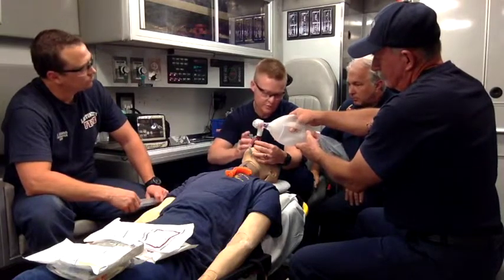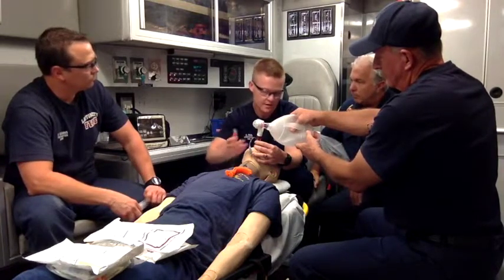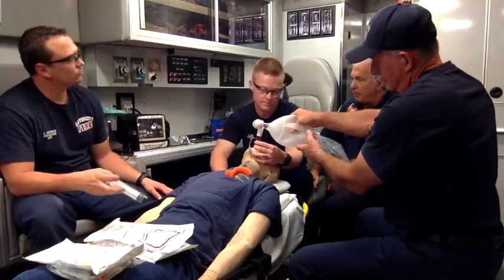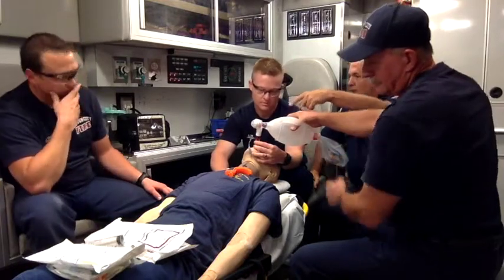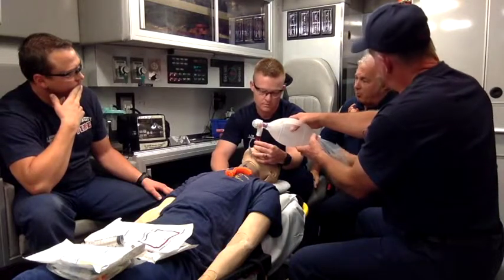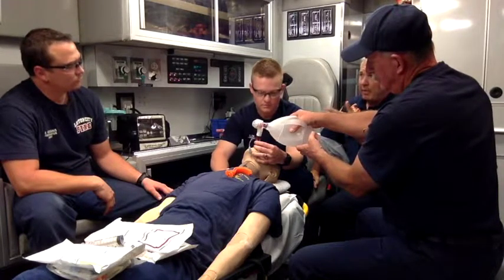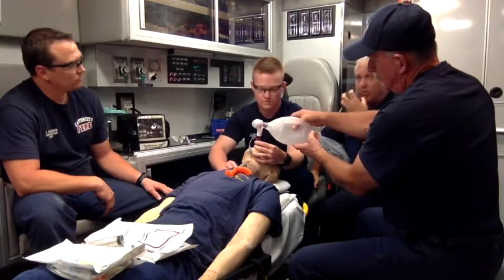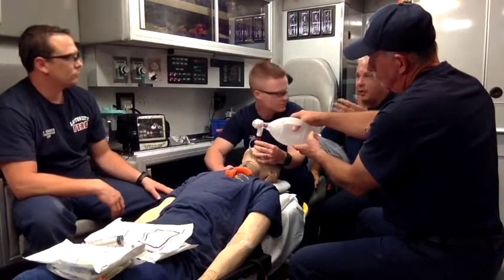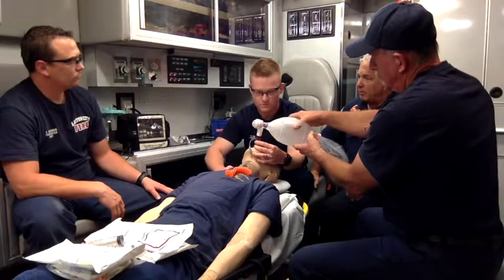Awesome. I've got a question for you. Sure. So as we got this placed, and then we talk about having twill tape, and some of these rigs we don't carry it, or it comes up missing. Can we use the manufacturer's securing devices? Will they fit on them? So I think you could on some of them. Like the smaller ones, you could for sure. The 4 and the 5, I'm not so sure. So maybe what we should do is have everybody practice doing twill tape, because if you've not put a half hitch on one of these before, especially now that we're using the manufacturer's recommended securing devices, it can be a little bit of a challenge. So after the video's done and we all get together as crews, that's a good thing for us to practice on and find out which ones we can and can't put that tube holder on.